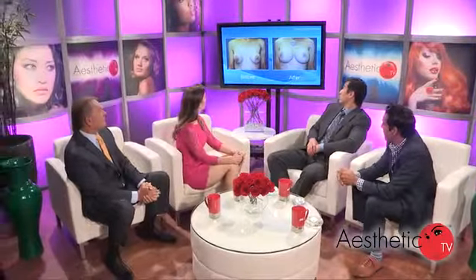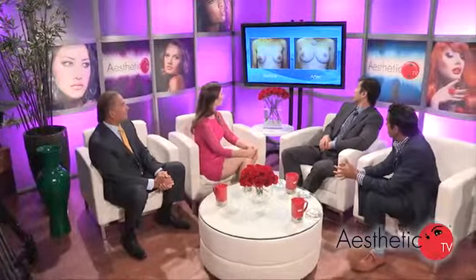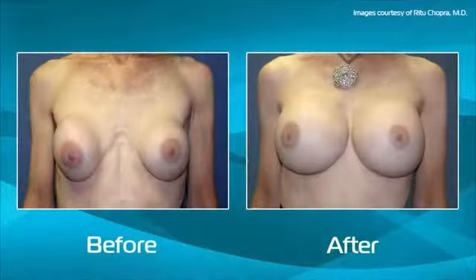Right. And we have another photo we want to show. If you can take us through this, of clearly a pretty severe capsular contracture case. Well, that's right. That's a grade 4 Baker capsular contracture. They're so contracted that you can see it, you can feel it, and she has pain. What I did on this particular case, I took out all that scarred tissue, and what we call a breast revision is really a breast reconstruction. So I took out all that scar tissue, put that acellular matrix in, and put implants in.